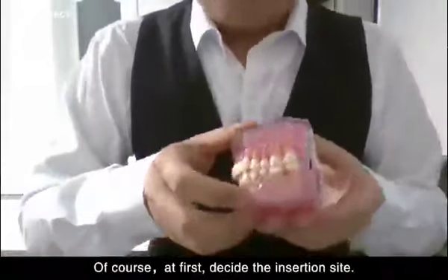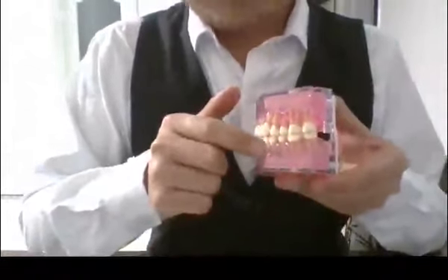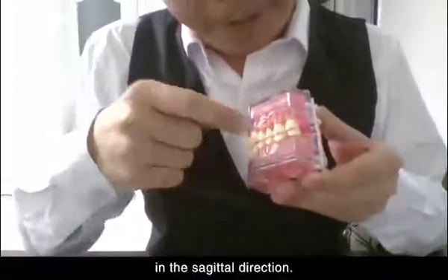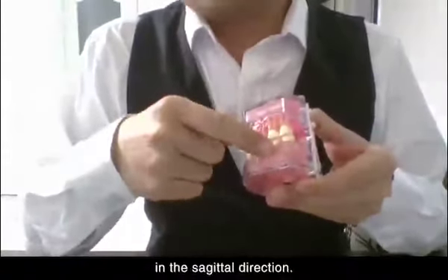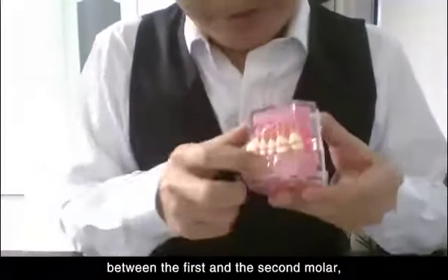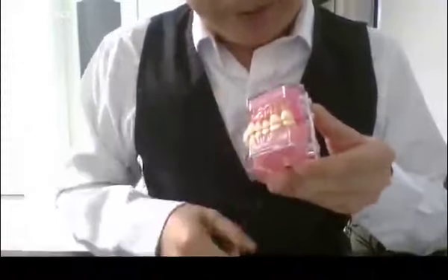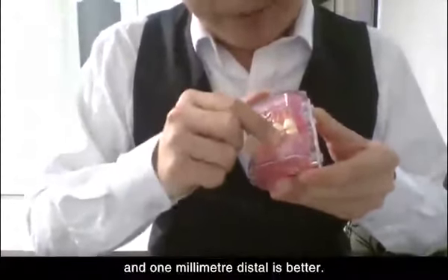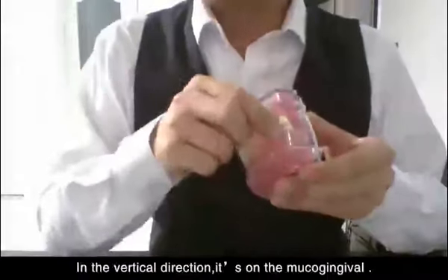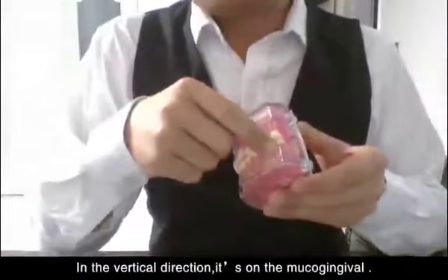Of course, at first, decide the insertion site. Also, we can touch it with our finger. In the sagittal direction, it's on the midpoint between the first and the second molar, and 1 mm distal is better. In the vertical direction, it's on the mucogingiva.